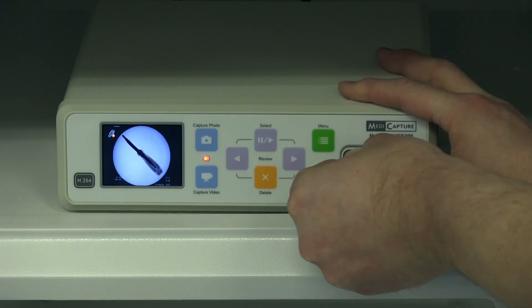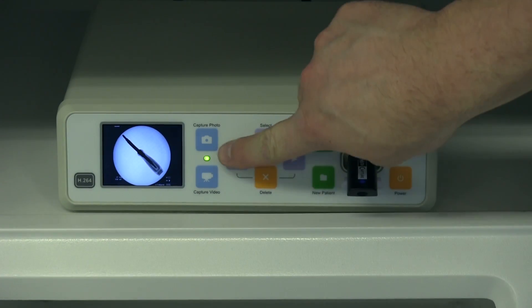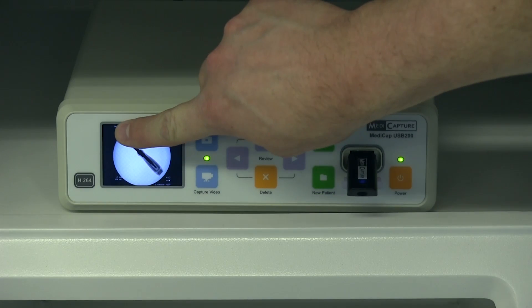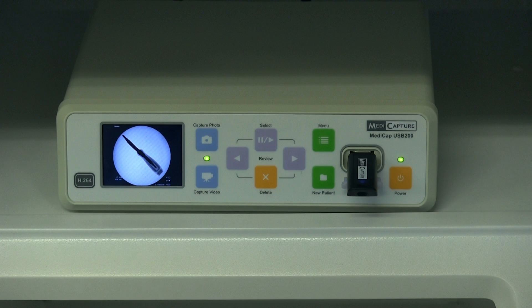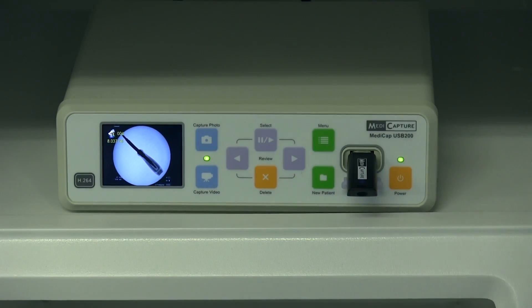When you plug in your flash drive, the LED light will become green and the icon on the preview monitor will disappear. To capture the image displayed on the preview monitor, simply press capture photo and wait for the green light to stop blinking. Be careful not to remove your flash drive while the light is still blinking, as this indicates that the machine is still in the process of saving that image.